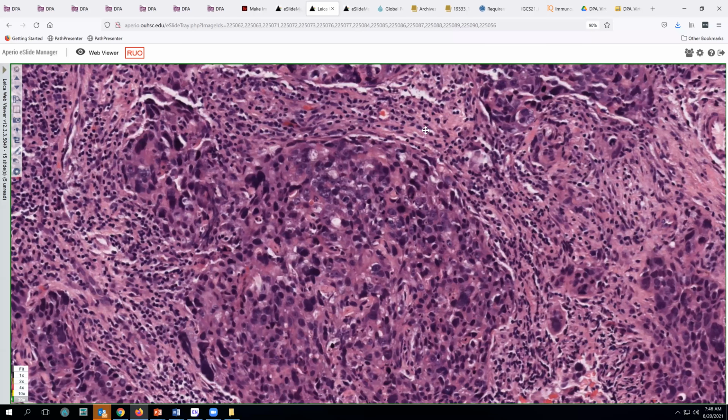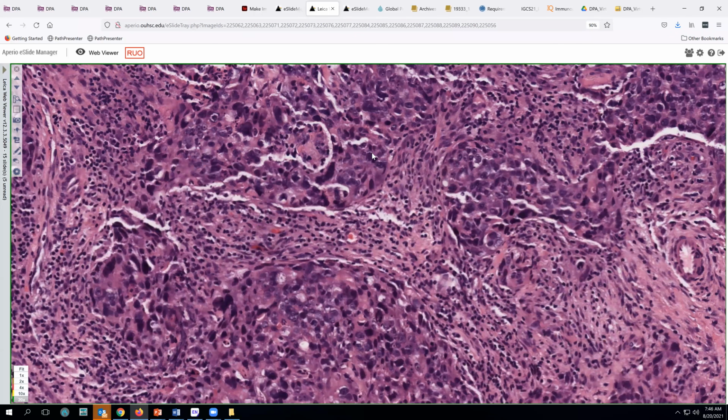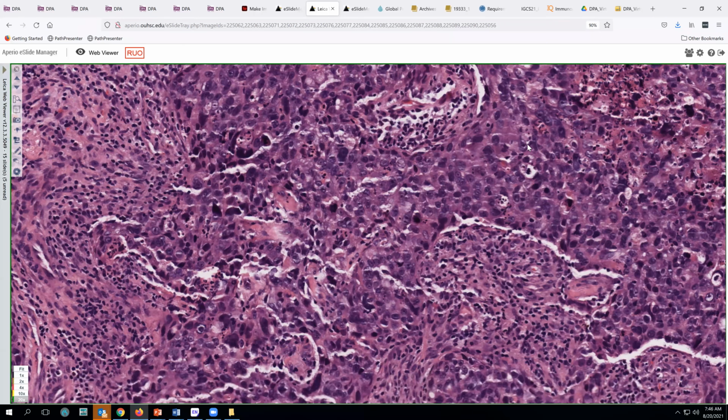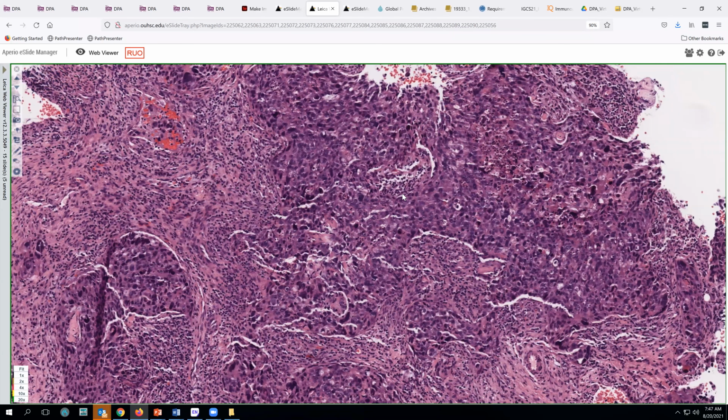Architecturally, again, no gland formation, we would score that as a 3. So then looking for mitotic figures, in this situation with all this apoptosis around areas of necrosis, you can almost be sure that this is going to be high grade. And in fact, when we did a Ki-67 score on this, approximately 80% of these tumor cell nuclei were staining positively with the Ki-67 marker. So that fits very well with a score 3 type of tumor.